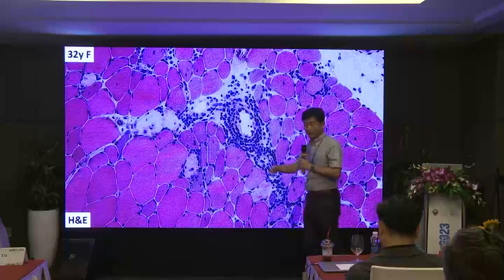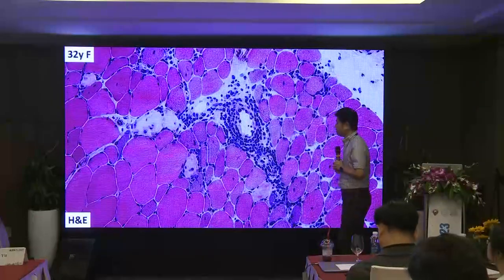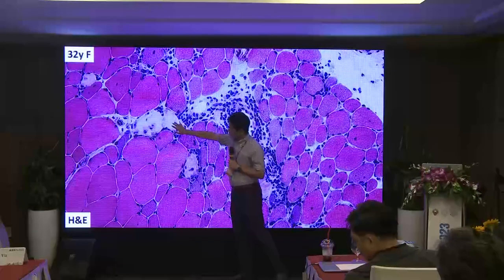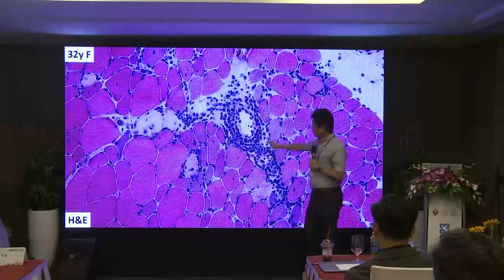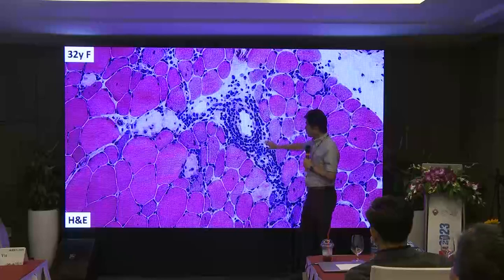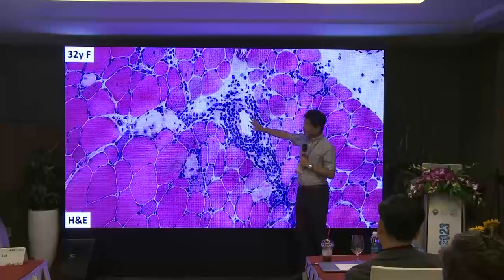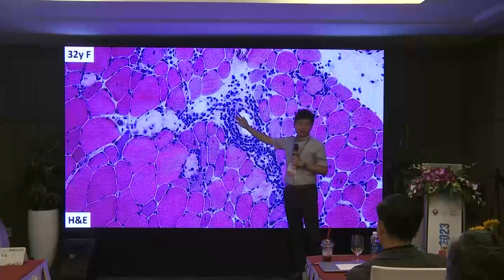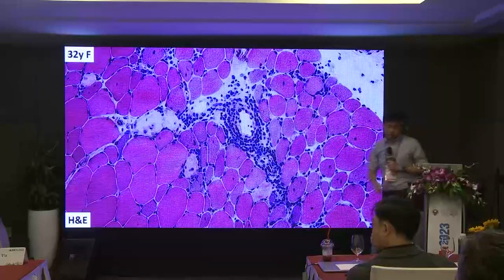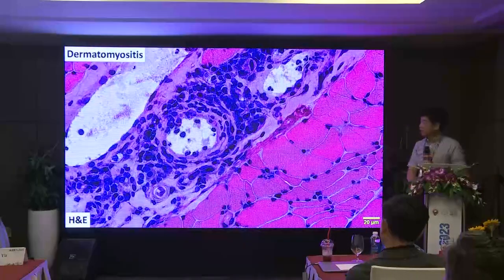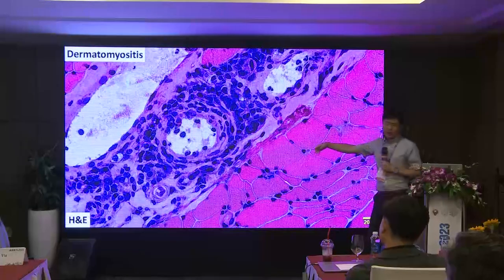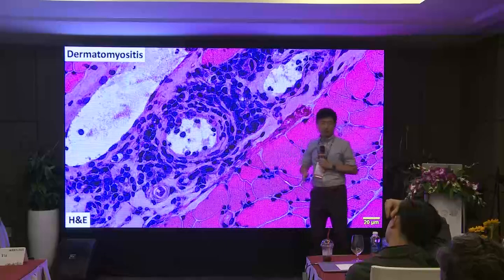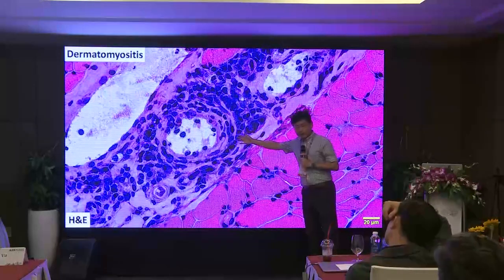In the interstitium — specifically in the perimysium surrounding blood vessels — you see lymphocytes. Lymphocytes are like people who come to see a traffic accident or fire. Here you have necrotic fibers and regenerative fibers — the traffic accident — so they come and see. This is called reactive lymphocyte infiltration and is non-specific. We never make a diagnosis of myositis based on this finding alone.